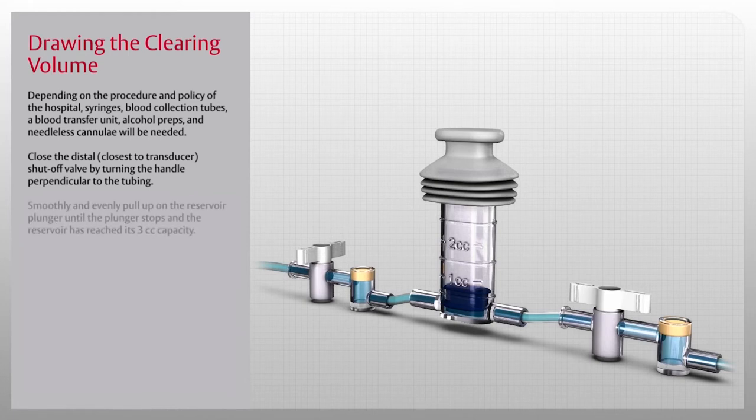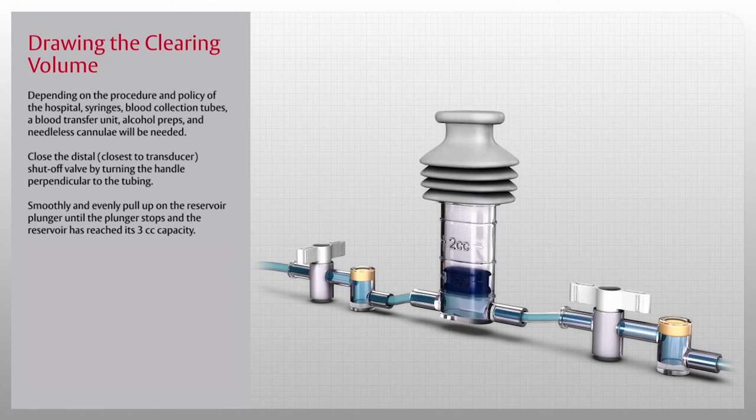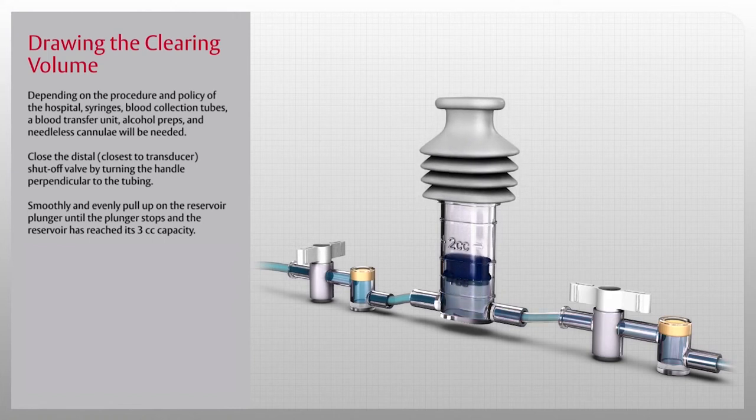Now, smoothly and evenly pull up on the reservoir plunger until the plunger stops and the reservoir has reached its 3 cc capacity.